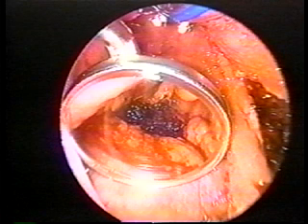Although the number of patients in our study was too small to demonstrate a difference in complication rates, we feel that by achieving more precise tissue removal, we can decrease the risk of postoperative velopharyngeal insufficiency.